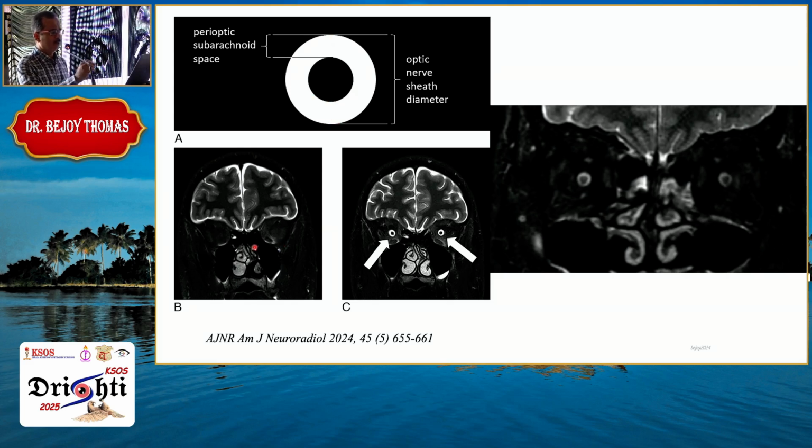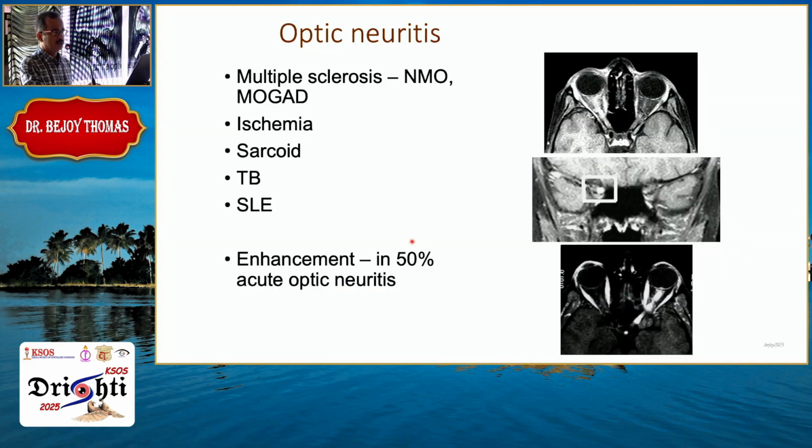In intracranial hypotension, you can see the optic nerve fluid is getting drained out, and you can see it is not there, whereas in raised intracranial pressure, you can see that this perioptic nerve fluid is increasing.